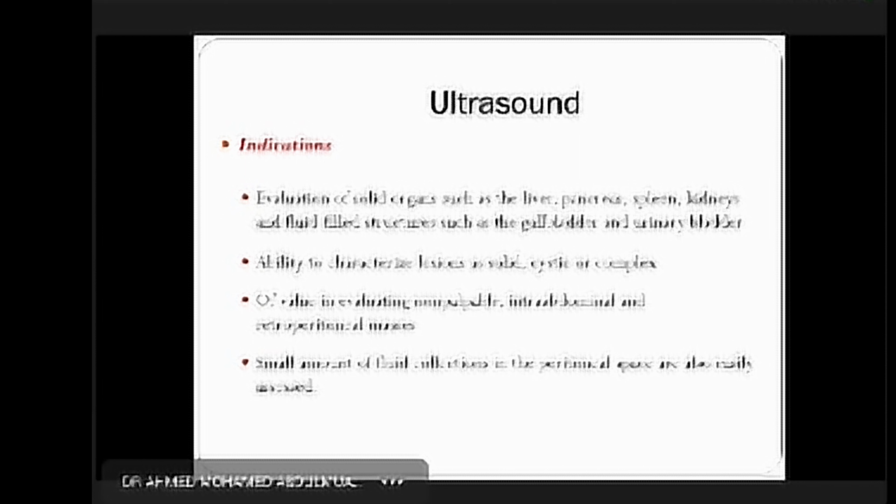As well as if you want to do ultrasound for the pelvis, the bladder should be full. Why? Because when the bladder is full, it acts like a window through which you can see the deep structures of the pelvis, because the water will not stop the ultrasound wave, so you can see nicely and clearly the small structures of the pelvis, like the prostate, or the ovaries and uterus in the case of a female. That's why whenever you have an ultrasound for the pelvis, it is advisable to ask the patient to drink water.